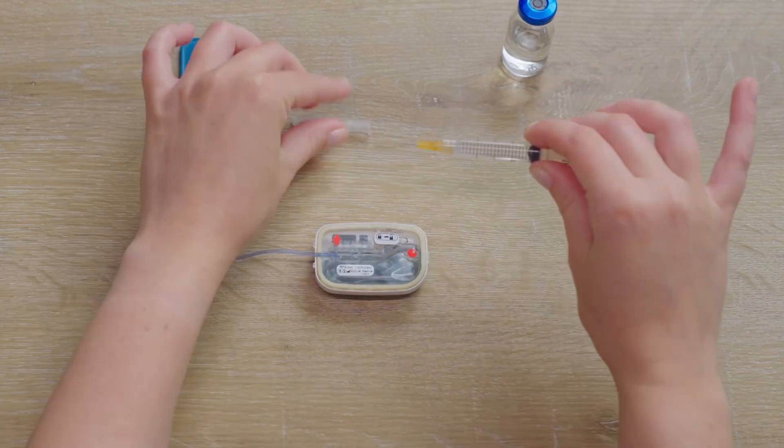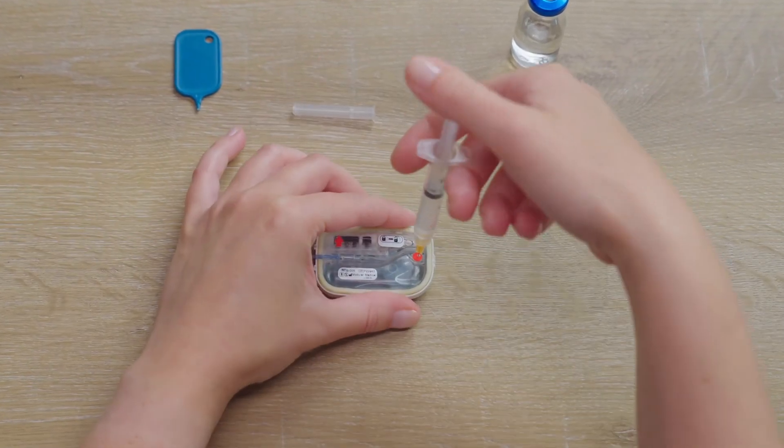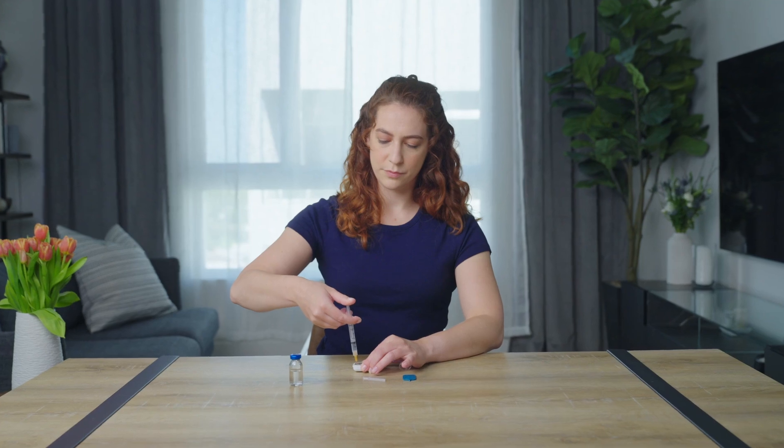A tone and indicator light confirm the system is on and ready for filling with insulin. The cartridge holds up to 300 units of rapid insulin and may be used over three days.